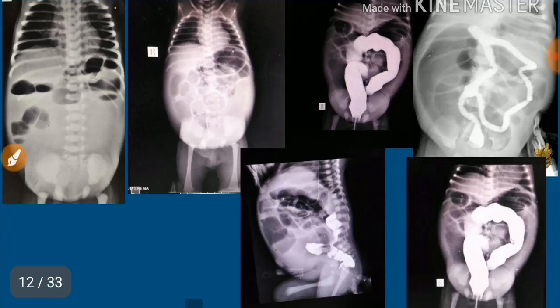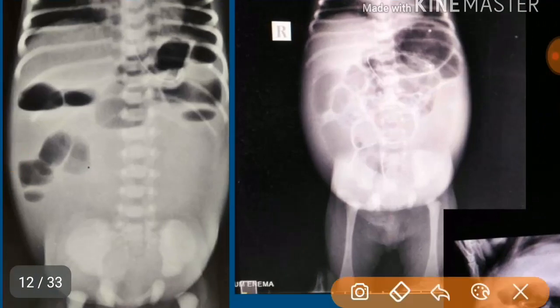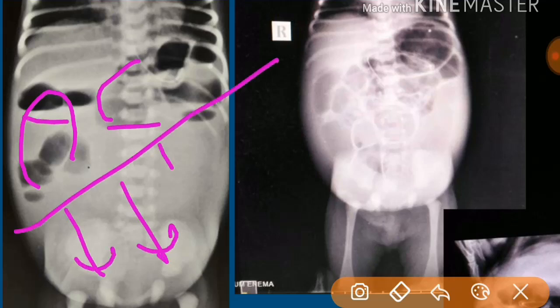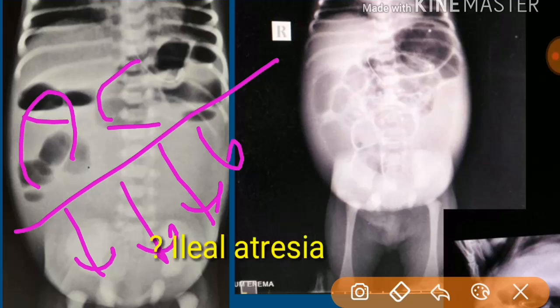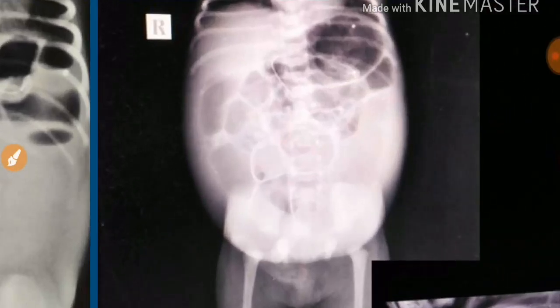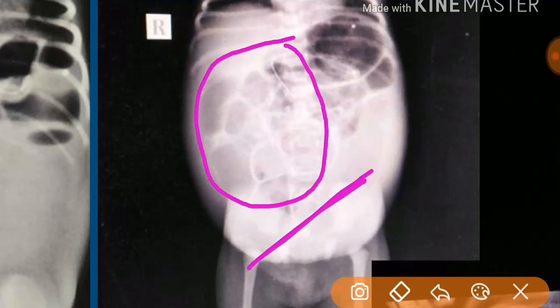I will explain with a case I have encountered. A patient presenting at postnatal hour 16 came with an X-ray showing dilated gas shadows — not very classical for ileal atresia — with air-fluid levels and paucity of air shadows in the distal bowel. Our first clinical suspicion was ileal atresia. Since the picture was not classical, we proceeded to a contrast enema. We pushed in a bit of air first so the loops would be more visible, and again saw paucity of air shadows in the lower abdomen, more towards the right side.